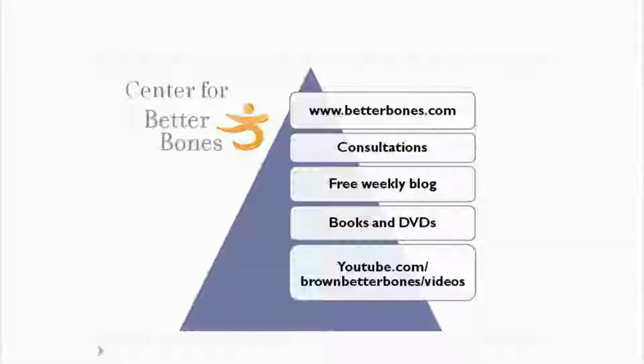You're going to get lots of valuable information, so just sit back, relax, and learn how to understand your bone density test. Become empowered. Now, just as we begin, remember that this is a video. If you don't understand everything when we go through the first time, don't worry. You'll be able to listen to it over and over until you have captured all the information about understanding your bone density test. I'm glad you're with us. We're going to have a lot of fun. Let's begin. Today we're talking about how to understand your bone density test.